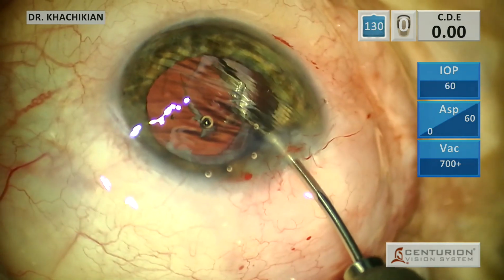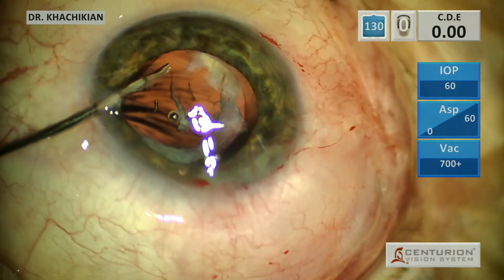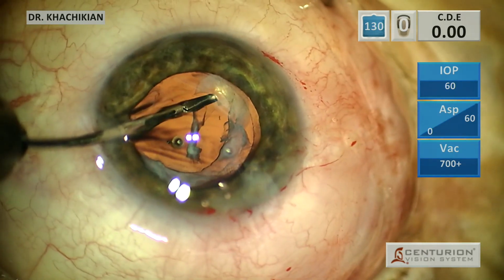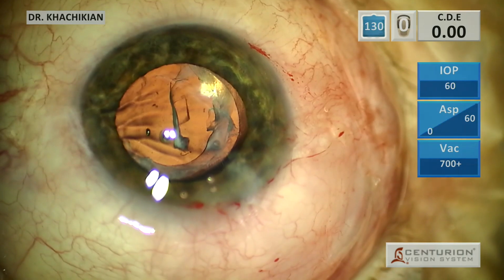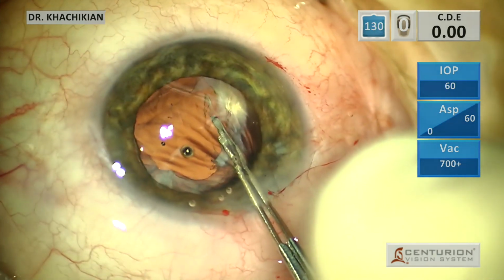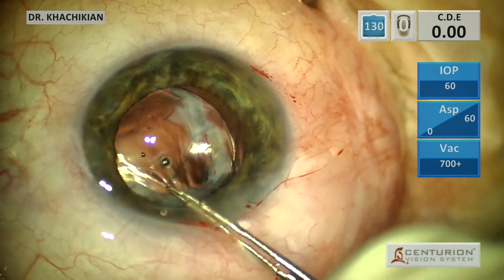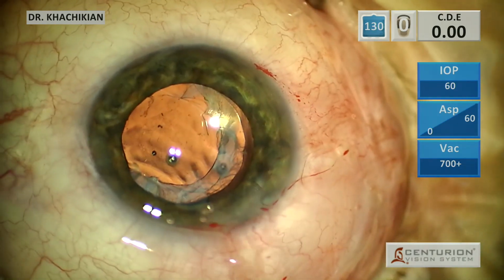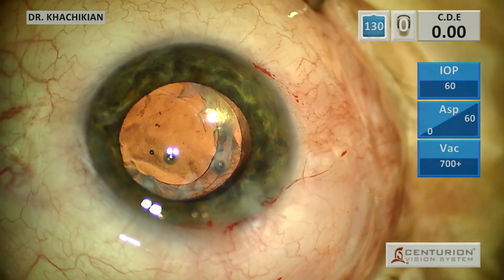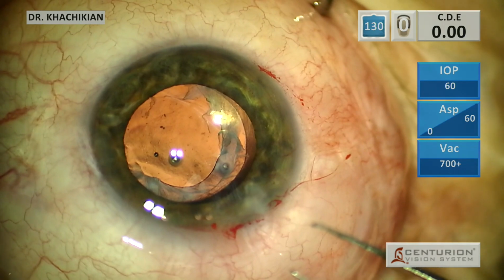Let's see what we got here. Let's see if we can cut this. I don't know. There's been a lot of traction on that area already. Just cut that off there. There we go. Normal capsular rhexis forceps. See what we can do here. Perfect. Get that little remaining bit maybe. But now obviously the anterior capsular opening is much more round. We've removed some of that scar tissue there.